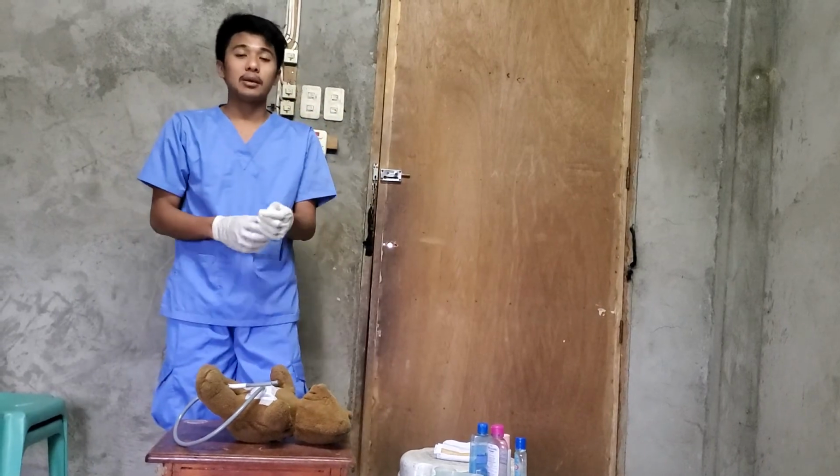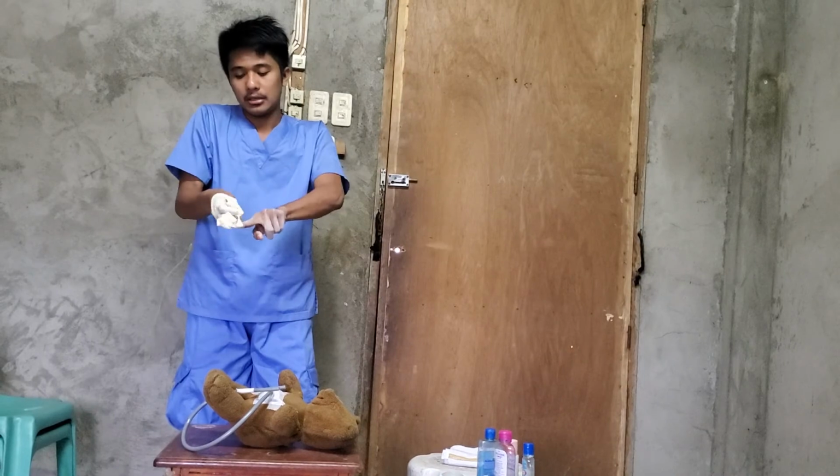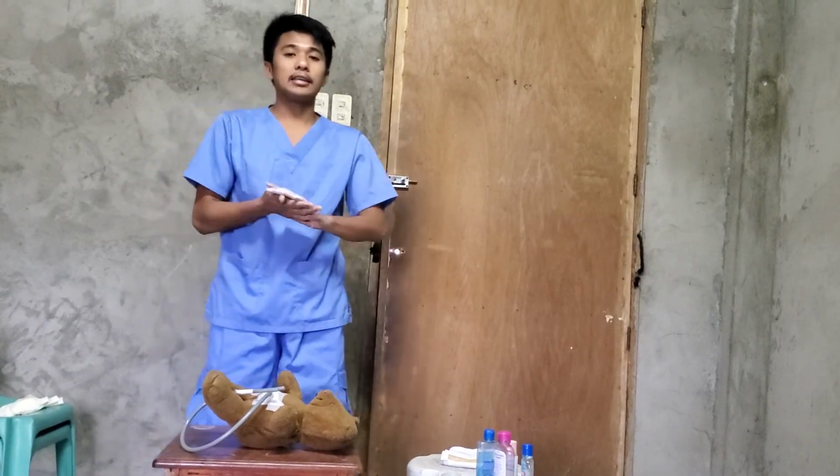Then after that is remove the gloves and dispose in the appropriate receptacle. Then after that is perform hand hygiene.